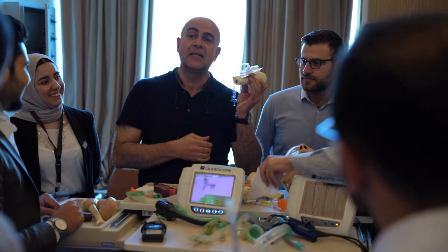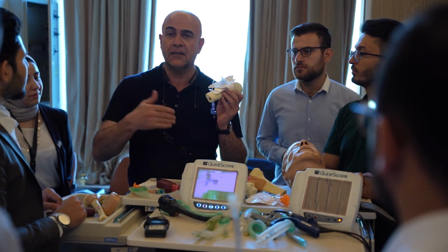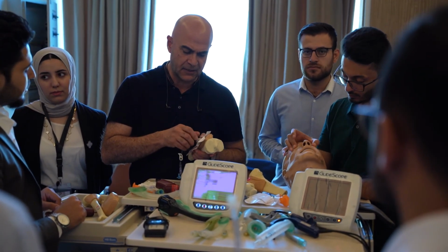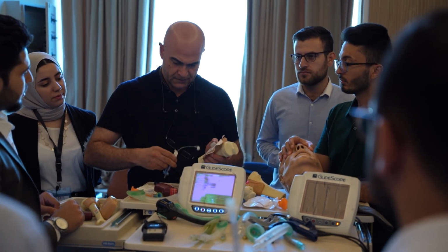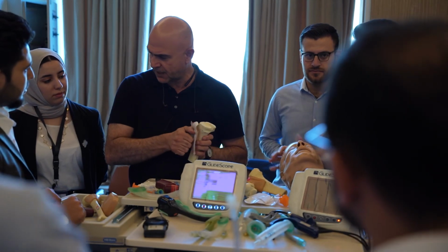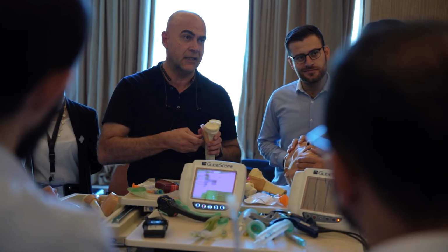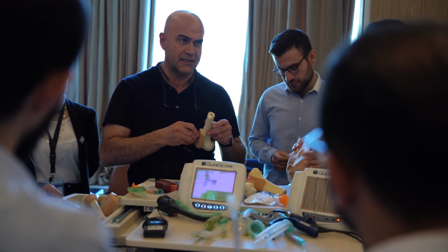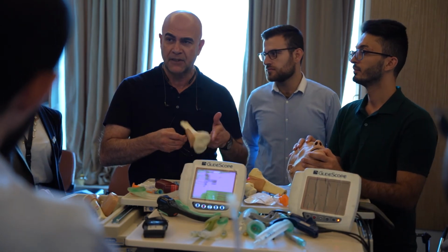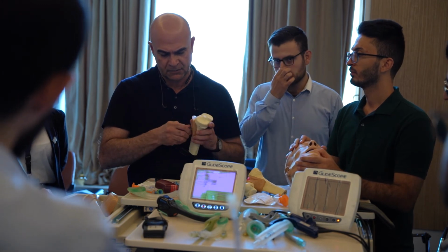You can maintain this up to 12 hours unless you are going to find intravenous access. What are the complications? Infection, bleeding, or fracture sometimes, pathological fracture later. Iatrogenic, yes, it will happen, or extravasation sometimes, and in the conscious patient this is very painful. So how are you going to minimize that? By local anesthesia. What is the maximum dose allowed in an adult?